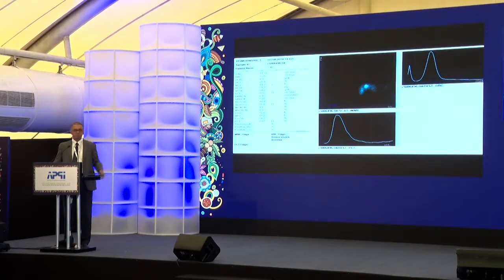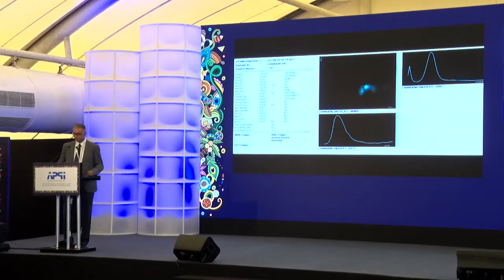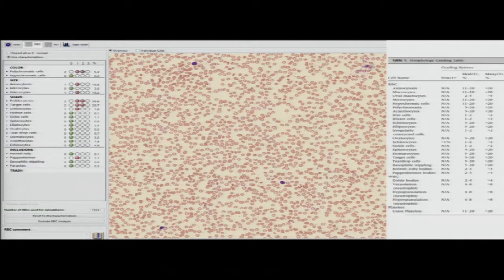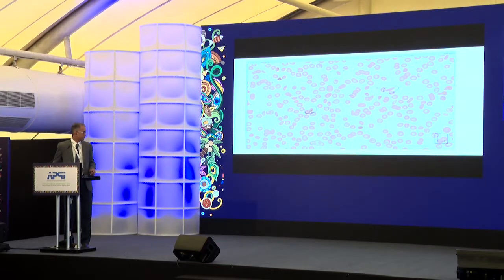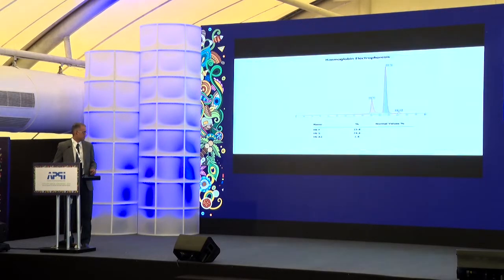This case with a hemoglobin of 9.2 showed target cells and strangely it says sickle cell 1.1 percent with hemoglobin S of 74 percent.